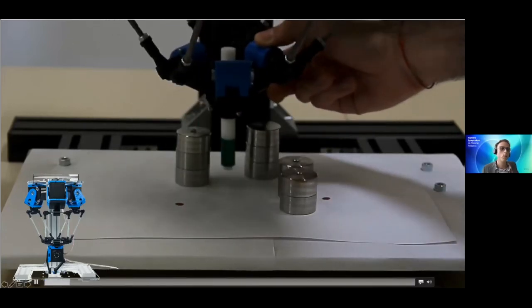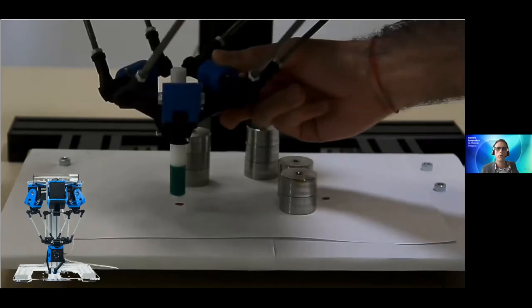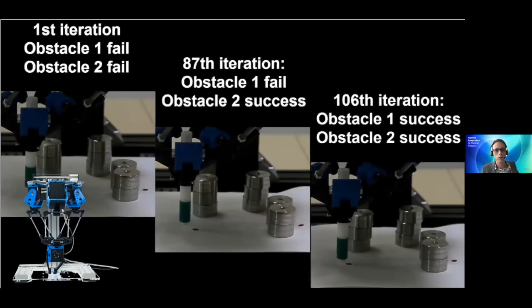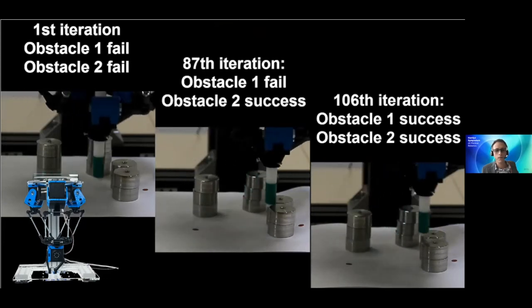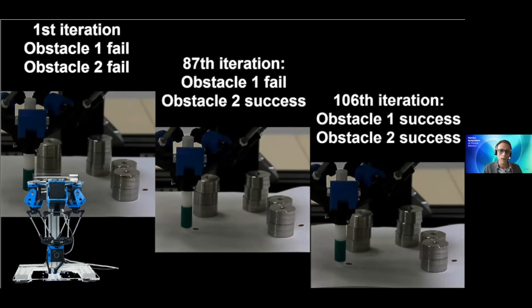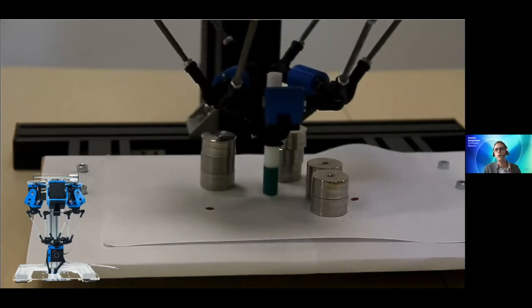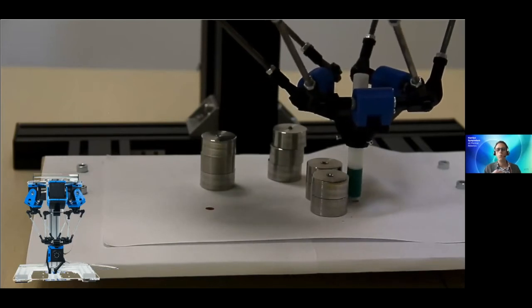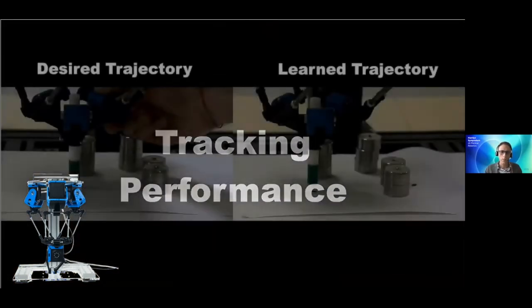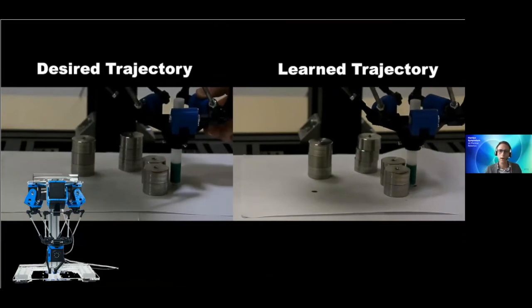So this is a Delta robot, which is an articulated soft robot. So you have elasticity at the joints, softness at the joints, but the robot is still rigid in a sense. What you want to do is to learn how to track the trajectory that the user specified, and this can be done with this process of learning by repetition that as humans we are so familiar with. In the end, this is a learning process that is based on the model in the sense that we use the knowledge of the model to understand how to update the control action, but apart from that, there is no model-based part. And in the end, the system is able to learn to track the desired trajectory in a pretty accurate way.